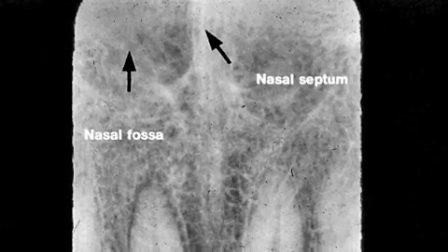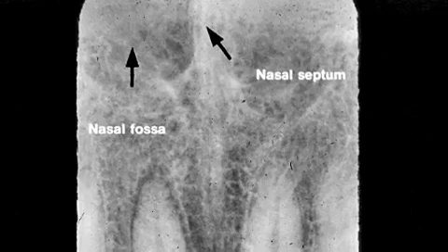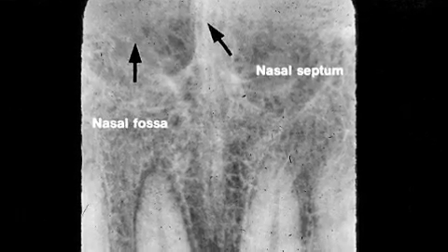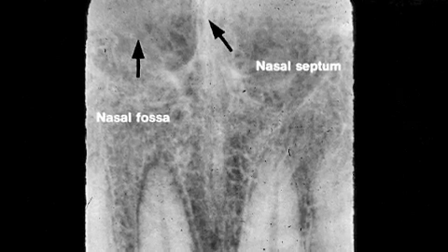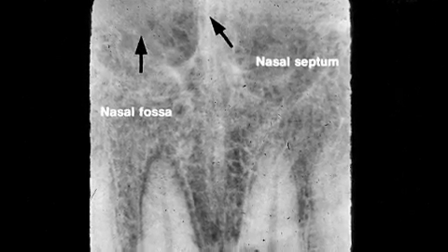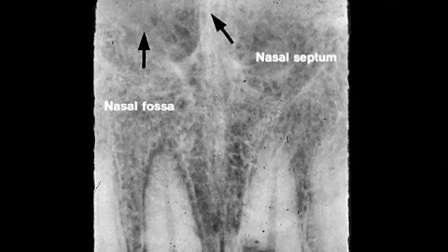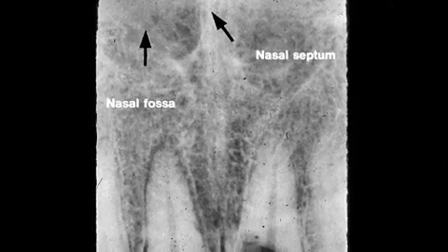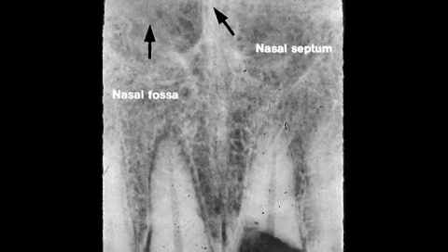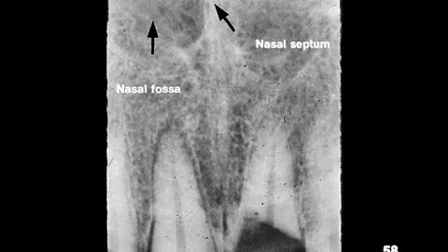The arrow in the center points to the linear radiopaque nasal septum. On either side of the septum are the radiolucent nasal fossae. On the earlier slide we saw the inferior nasal concha inside the nasal fossa; here we do not.